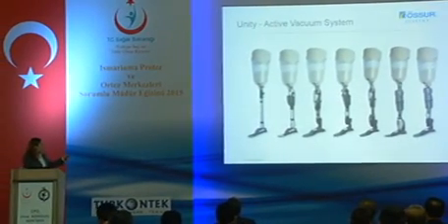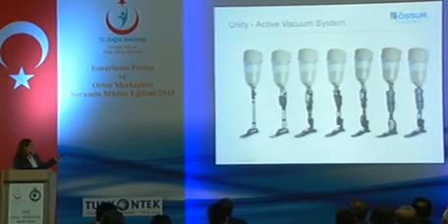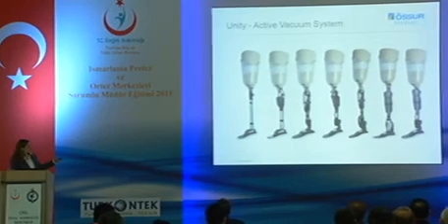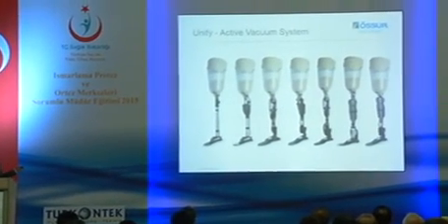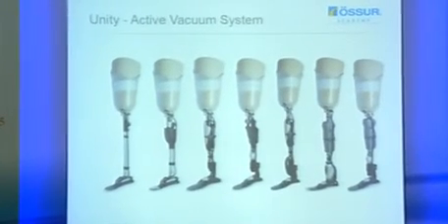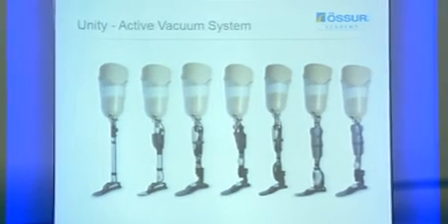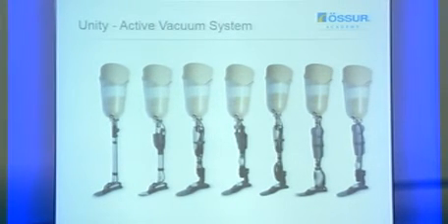What you can see here is that you can actually use the Unity with any type of knee. Because you just need it to hold the tube so that it doesn't get crushed when there's knee flexion, and then any sort of foot that the pump will fit in the flex foot range that will expel the air out.